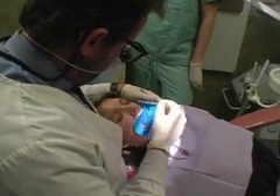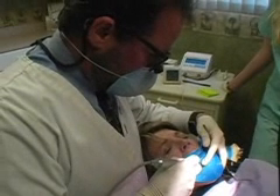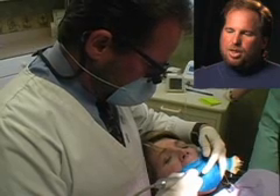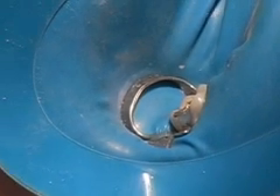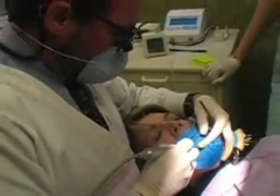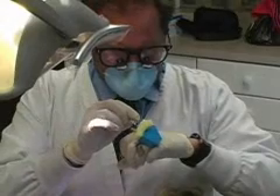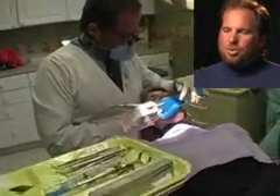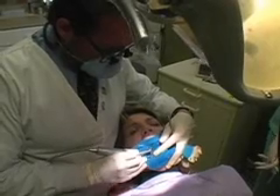After we know the root lengths, I'm shaping the inside of the tooth roots using a rotary file on a slow-speed handpiece. Here I'm irrigating the canal, keeping it clean with sodium hypochlorite — that disinfects as I'm shaping the canal. Engine-driven files increase the accuracy of the preparation inside the tooth, and they also make root canals a lot faster. Years ago it would take three hours to do a root canal; now we can do it in 40 minutes. The technology we have today really makes root canal much, much easier — for the patient and for the dentist.